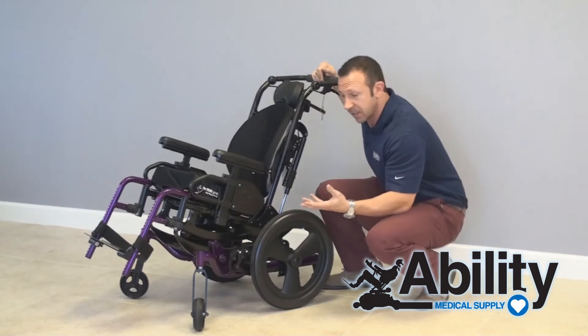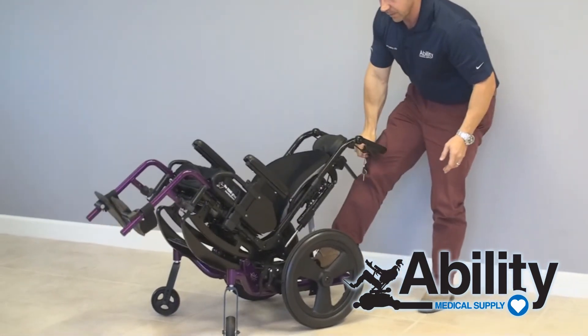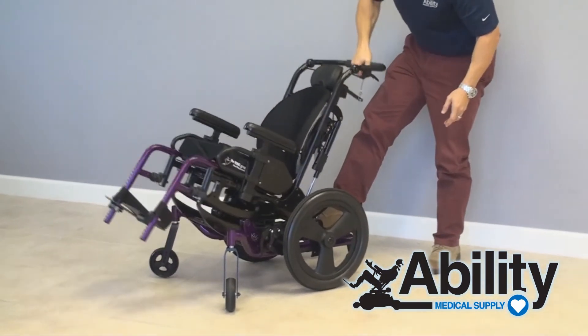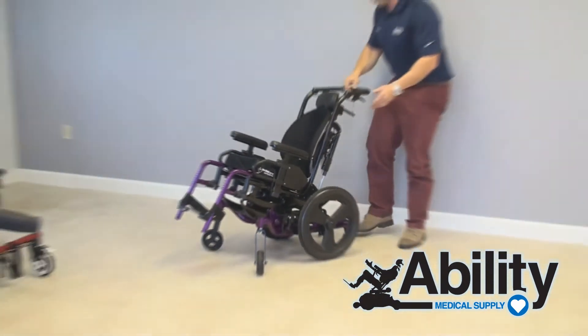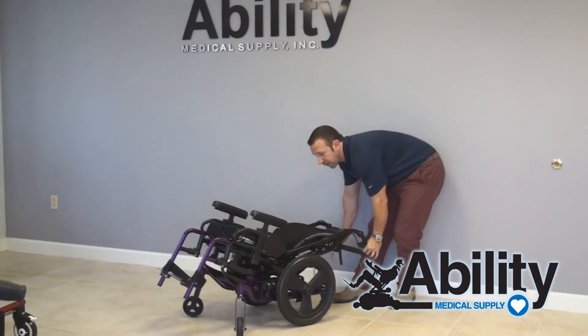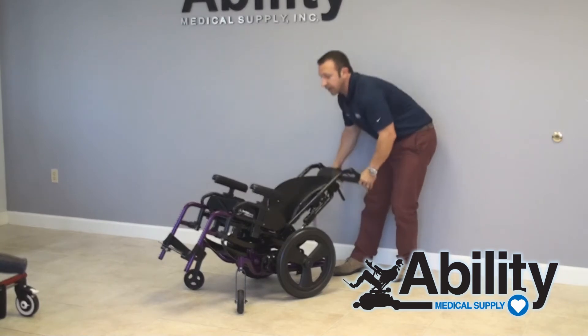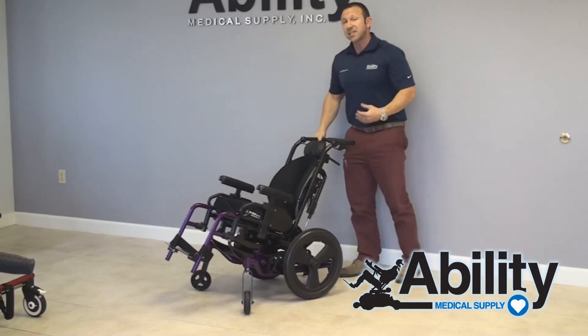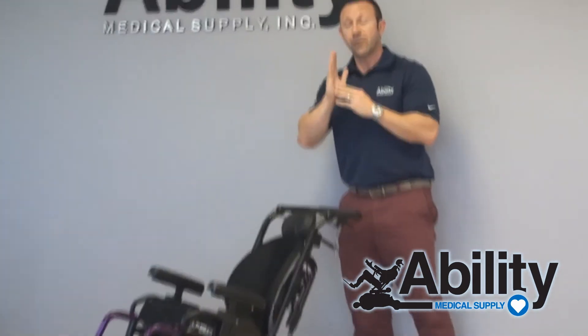This new technology is really awesome and it's really smooth. See how that works? The tilt goes up to 50 degrees and our recline goes up to a full 180. You can lay flat, which is great for a patient to rest in the chair, to adjust their pelvis either to or fro, and also for lateral transfers which occur all the time in these systems.